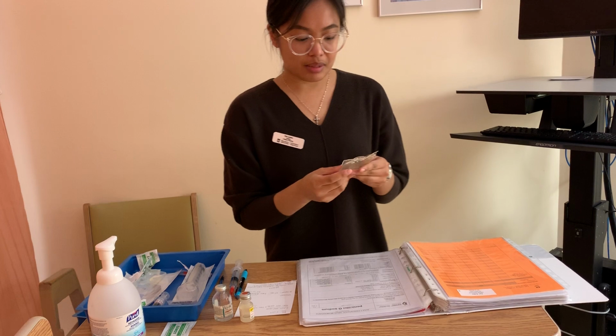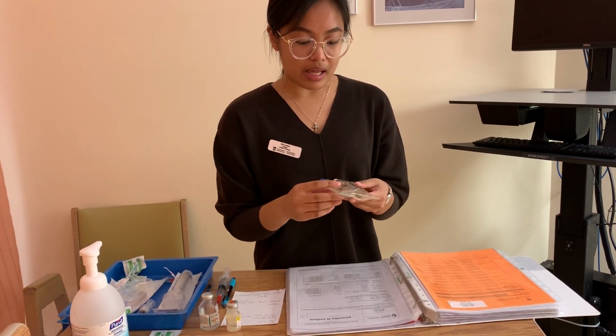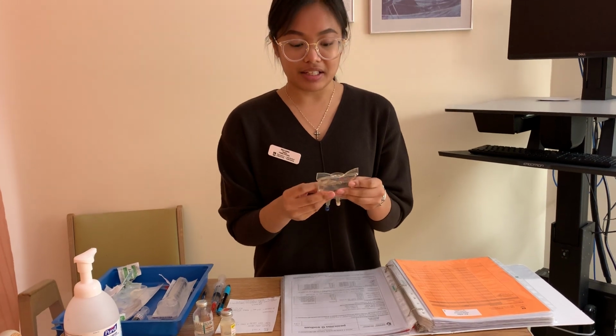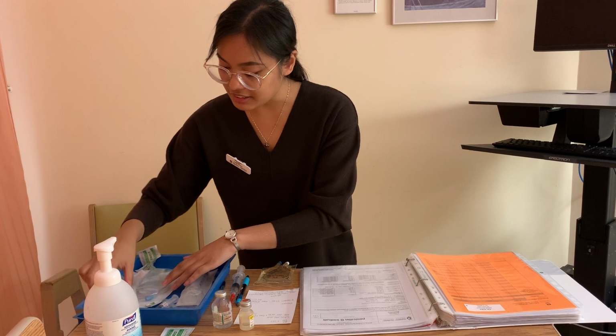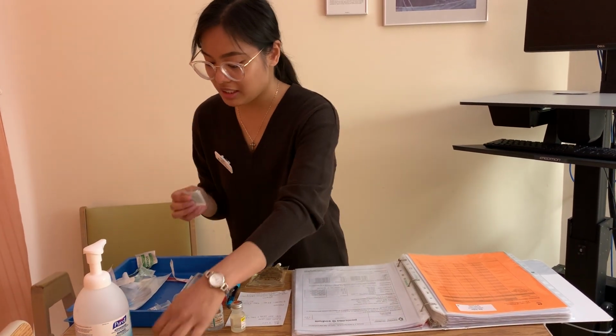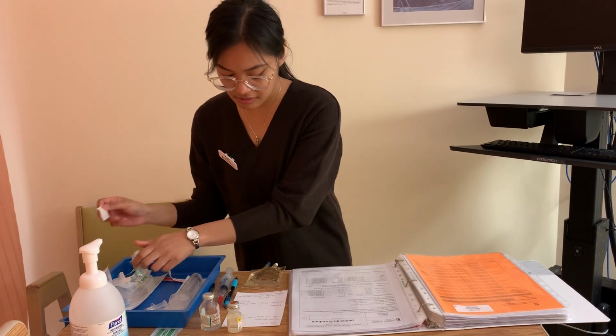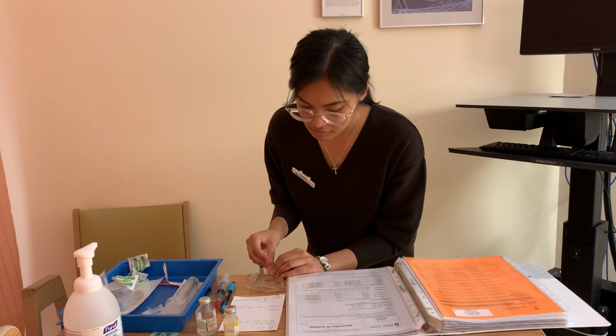So here I'm seeing the bag, it's intact. There's no sediment or anything. There's no leaks, and it's not expired yet. So first thing I'm going to do is swab for 30 seconds again and let dry for 15 to clean my port, maintaining sterility. Just to make sure it goes in the medication. And I think that is about it.